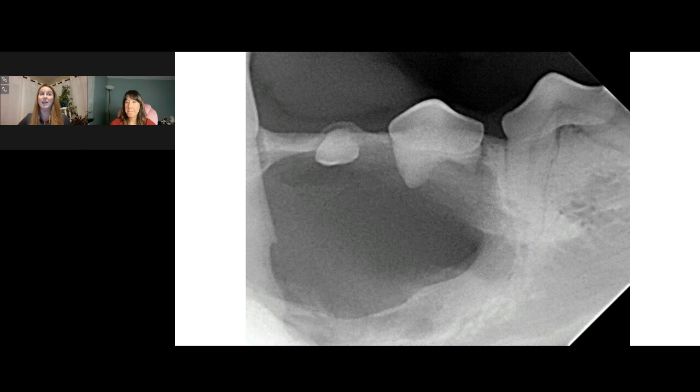There's not, other than if it is at or above the gum line, we have to take it out. There's not one rule to follow. It really depends on the situation. It depends on underlying conditions in your patients. It depends on if you have radiographs from 6 months ago and now you've taken them again and there's been no progress. Well, now we might be able to go 9 or 12 months. Now there's been no progress. Well, now we might be able to go 12 or 16 months.